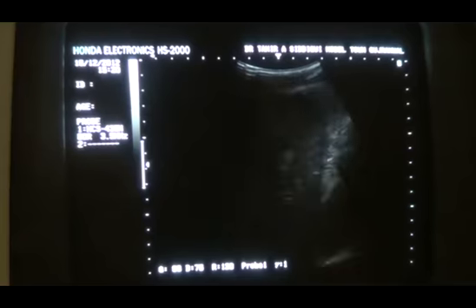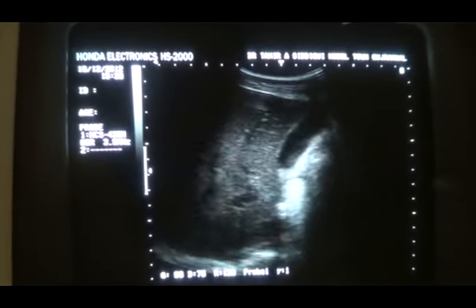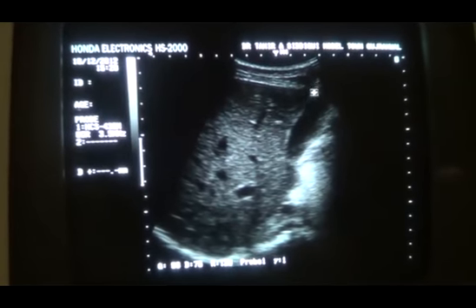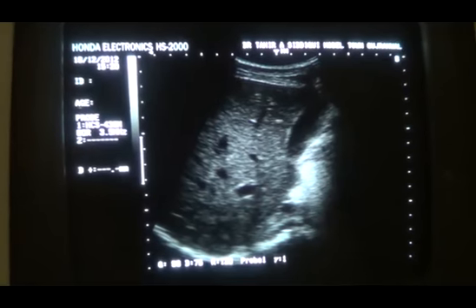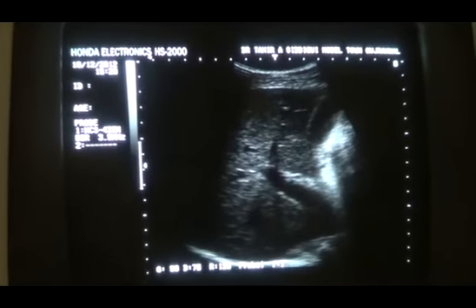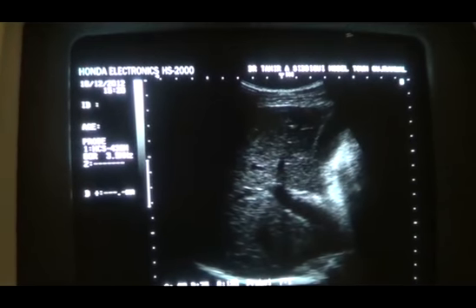In this case we will also see the shape of the gallbladder wall. It will be thin, regular in case the gallbladder is normal. And now see the portal vein, the periportal echoes. These are the normal periportal echoes.